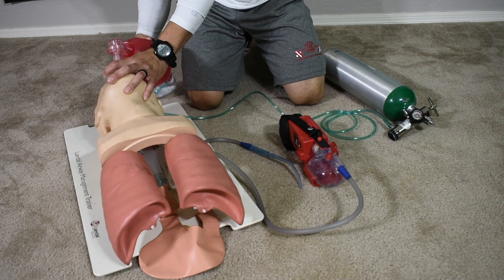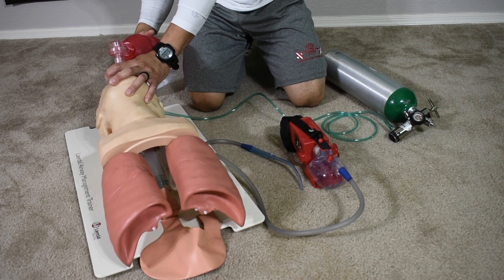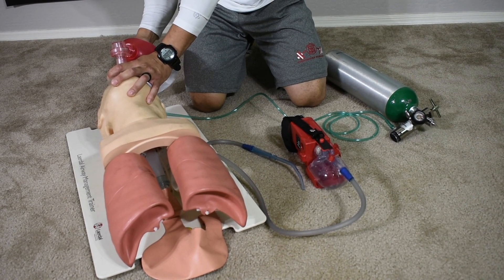How would you know if you're delivering appropriate volumes with each ventilation? Assess for equal chest rise and fall.